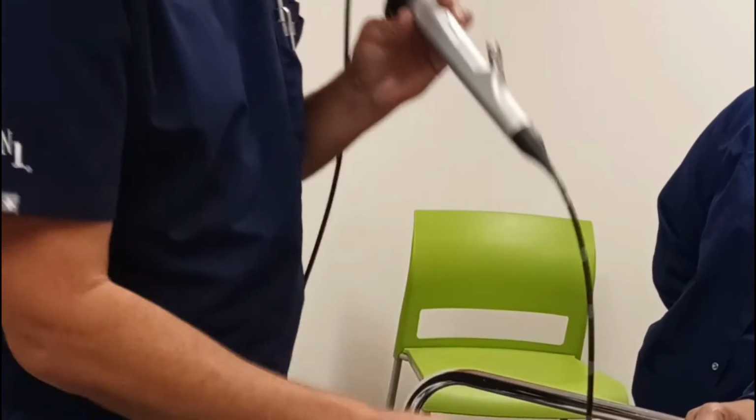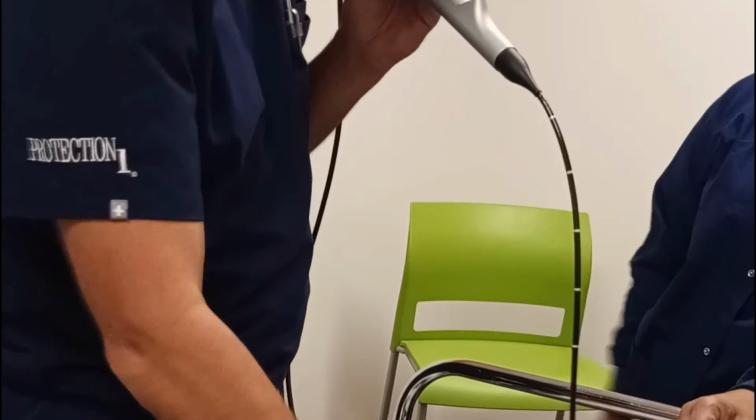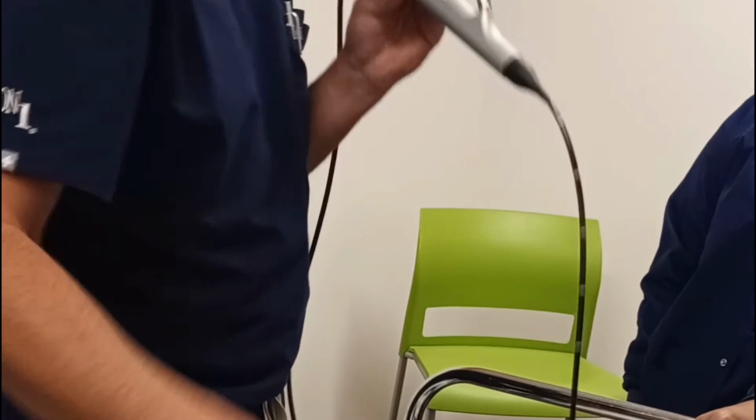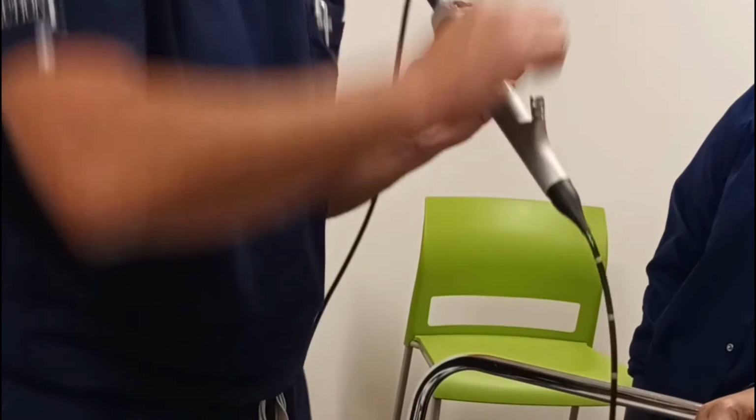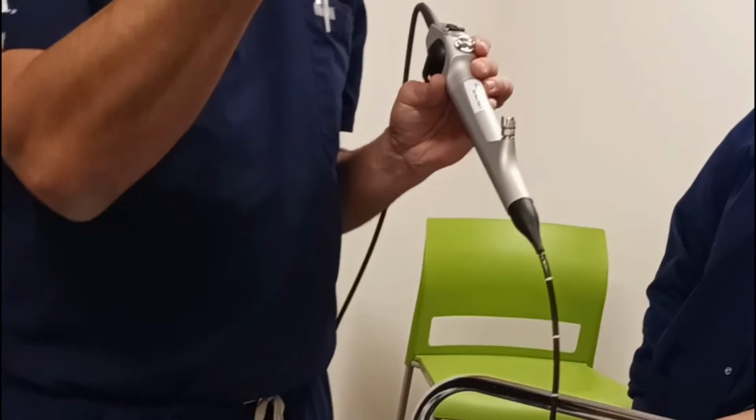So some people, once it gets to the distal tip, they pull the brush all the way through. Some people will wipe off the distal tip of the brush and then they pull it back up through. Wipe it off, stick it back through. You want to do it for a total of 3 times.